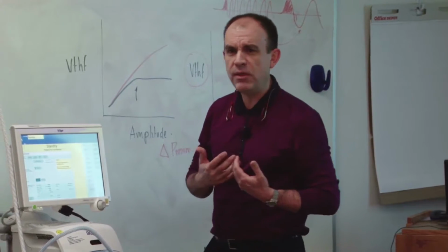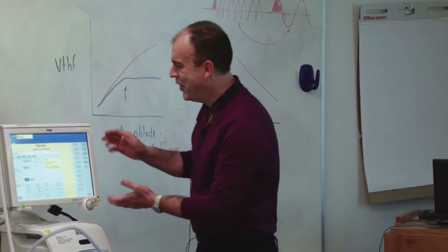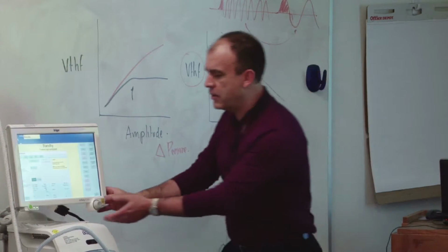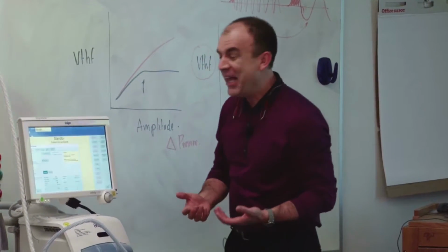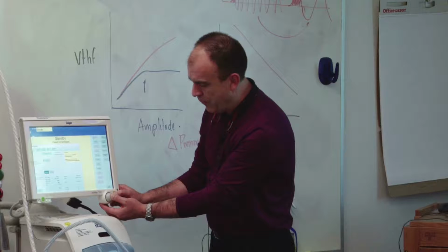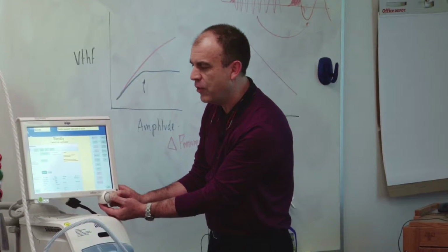And this we didn't learn with Draeger. I was actually taught this by one of the engineers that created this in Lübeck. And he said, obviously you can do this. And I said, nobody knows this, actually. And it's fairly easy. What you do is you just press the wheel and this alarm silence button for 30 seconds.